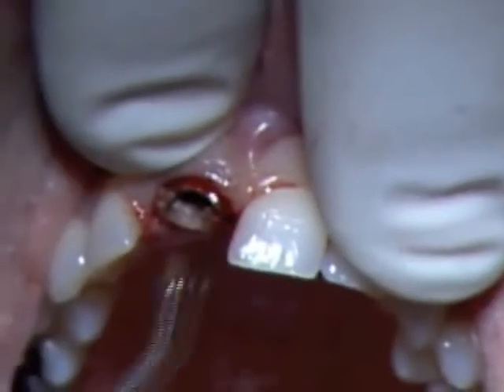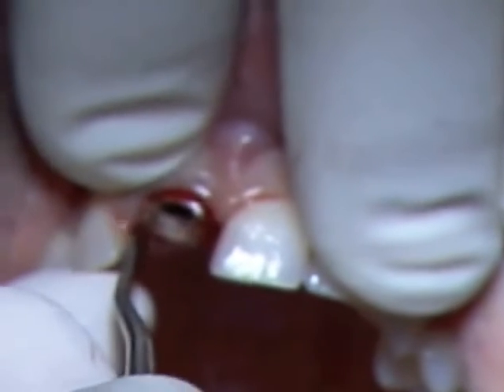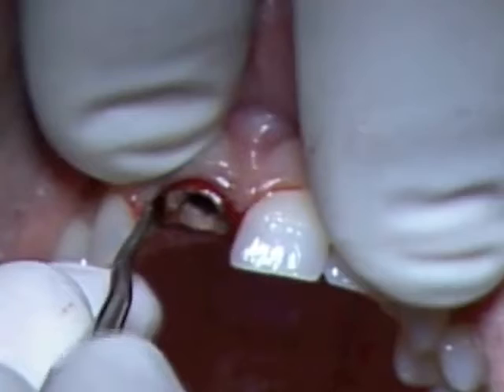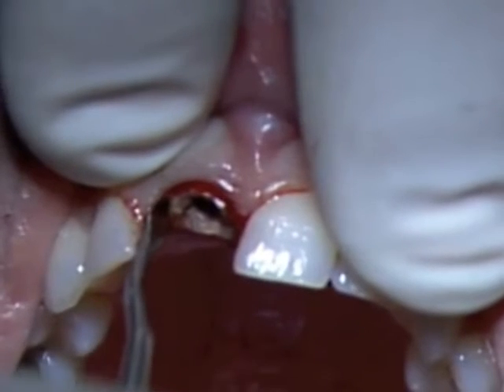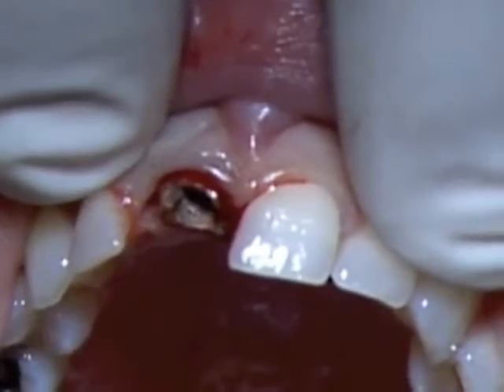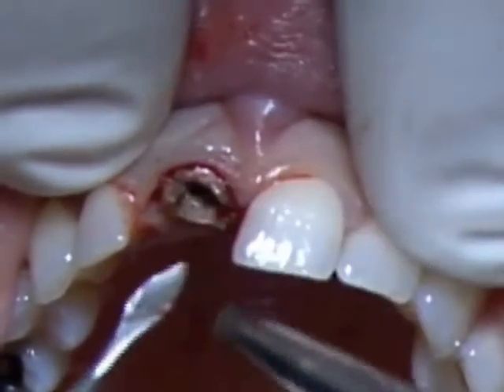After that, we will use a very nice periotome from Depela in Switzerland, which has the shape of a boat, and it's very pointy and very solid. We can also hammer it in between the root and the bone in order to mobilize fractured roots.